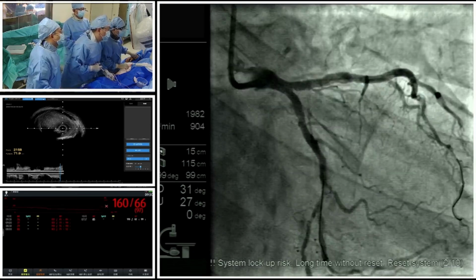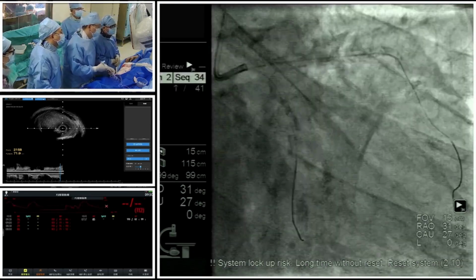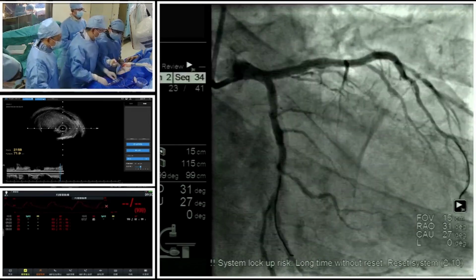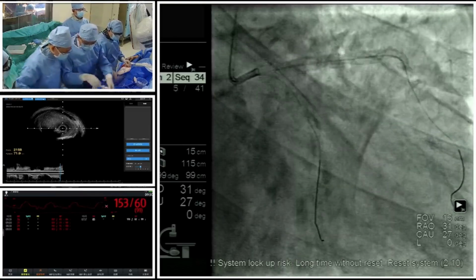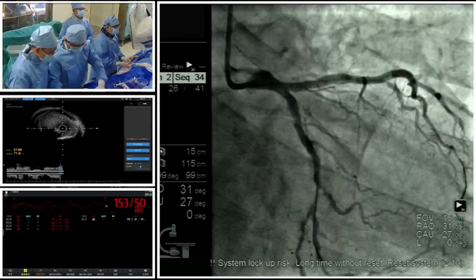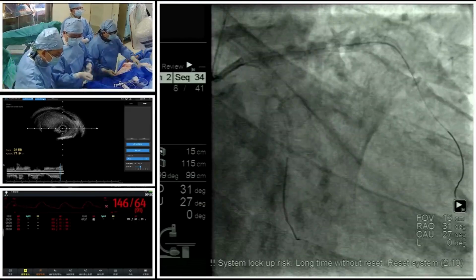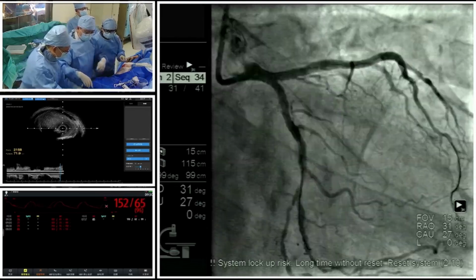But the use of RA was associated with a greater acute lumen gain. As we all know, the rota had a debulking effect on the calcification of all kinds of plaques. But IVL just makes some fractures of the calcification, but not the normal vessel or the lipid plaque.